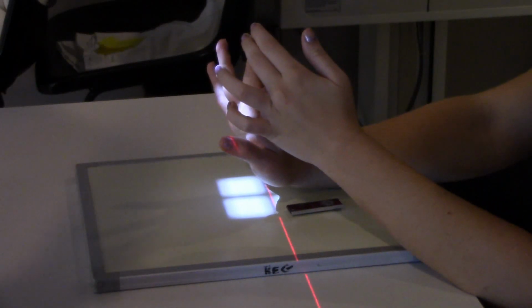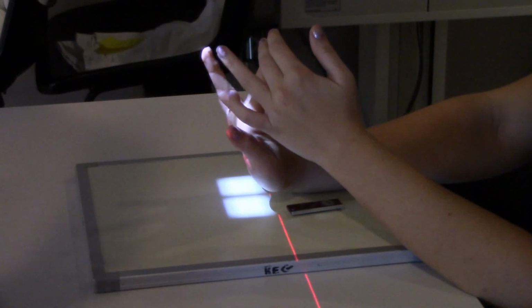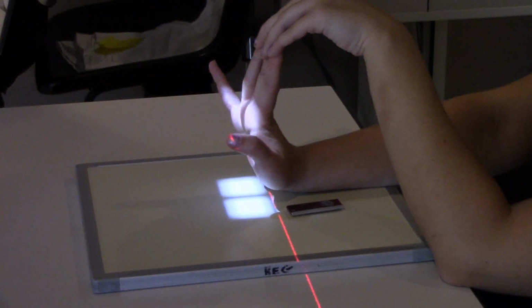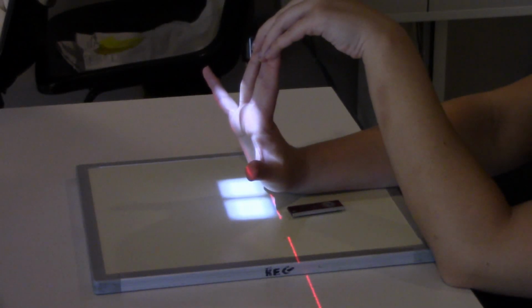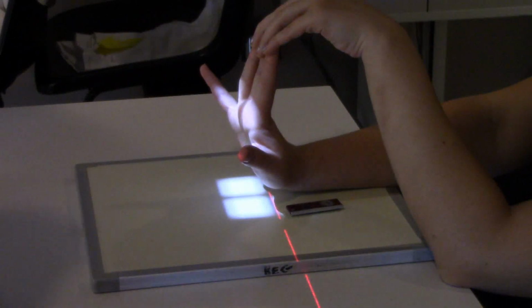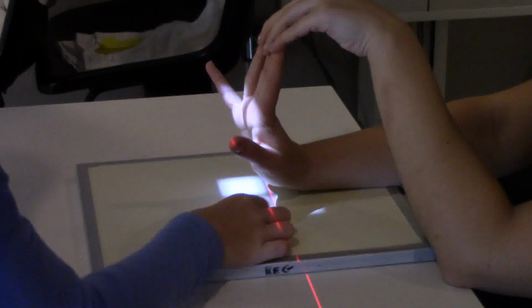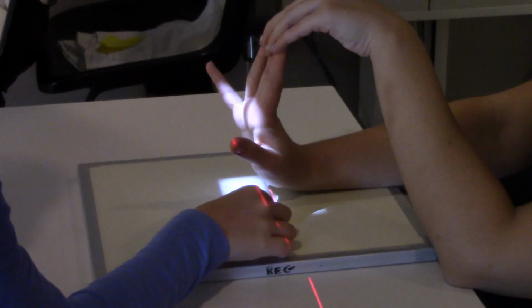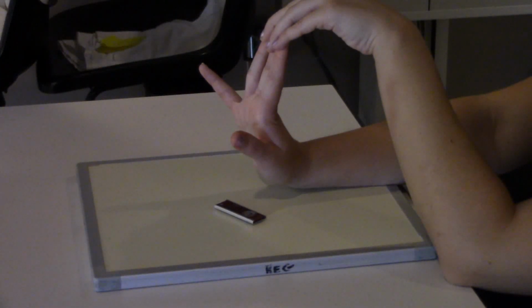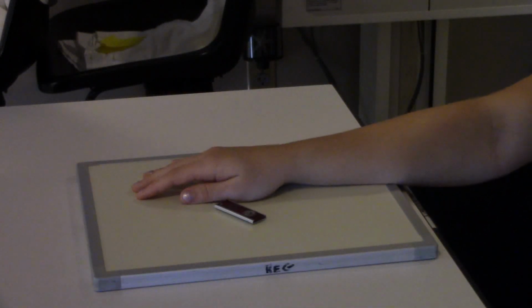Okay, is that as far back as you can pull your finger? I mean, I'm not trying to get you to hurt yourself. Okay, that's a little bit better, I think. Because we're not going to have a good view of those metacarpals. Those things are going to be all superimposed and appearing like end on. But we do want to get a good view. Basically this is just like a tangential shot down through the palm and through that carpal canal. It's not super pretty, but if the doctor wants to see how those carpal bones are oriented relative to one another, sometimes this shot can help.